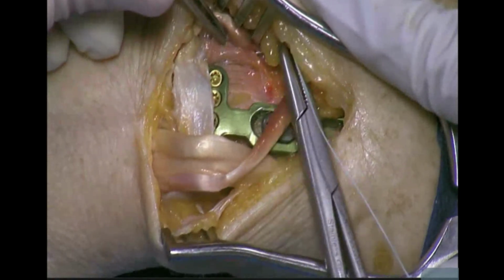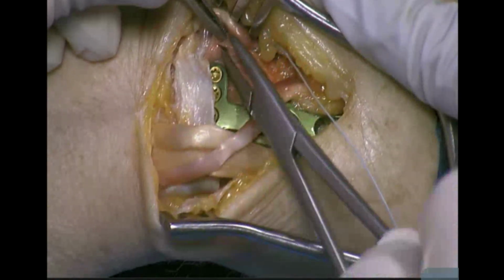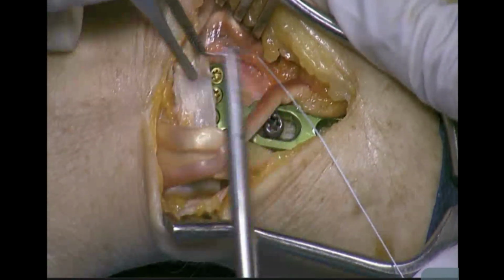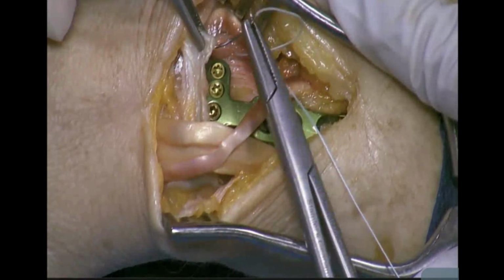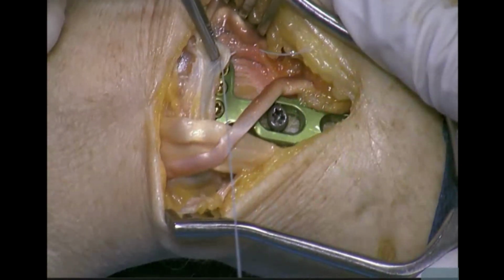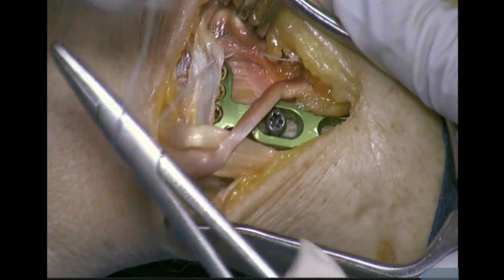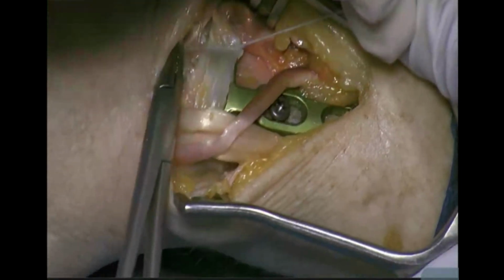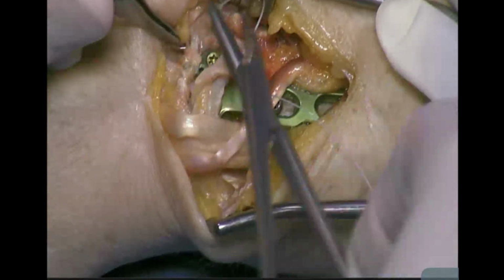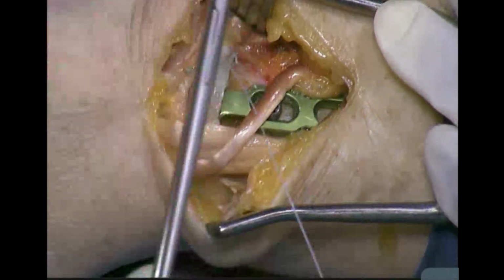Here's where this ulnar periosteum was useful to save. Sometimes it can be used to cover the plate. Sometimes it can just be used to help reapproximate the retinaculum. And here I can go to the periosteum or reinforce the capsular repair.